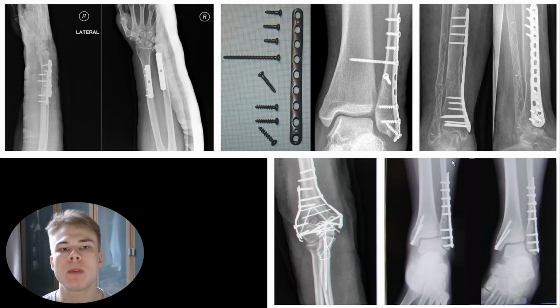You may have heard about people talking about plate and screws as a way of fixing a fracture, but did you know that there are actually 5 different modes in which a plate can be applied? These are compression mode, neutralization mode, bridging mode, buttress mode, and tension band mode.